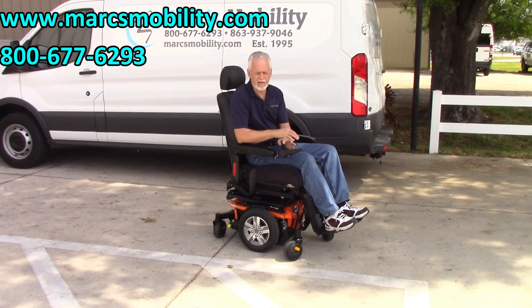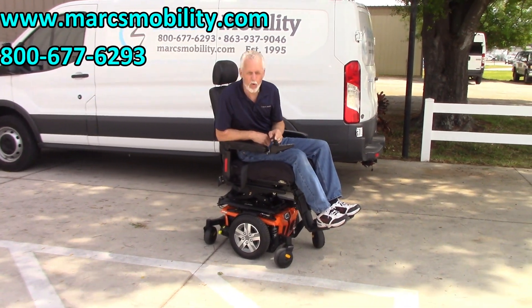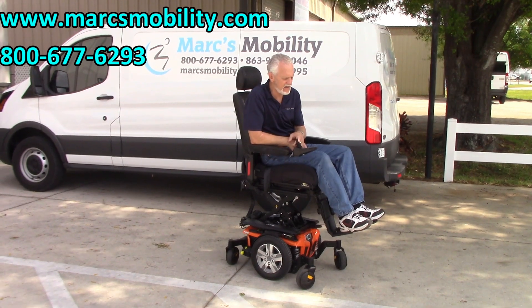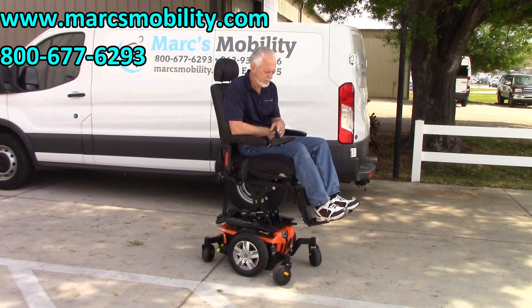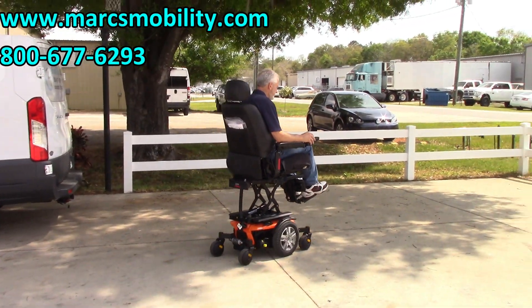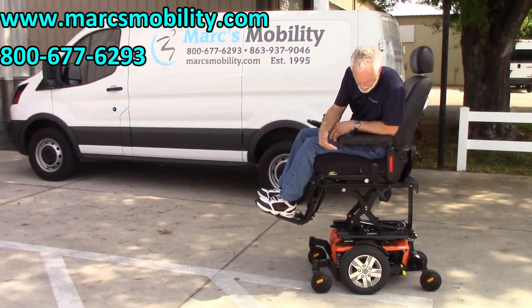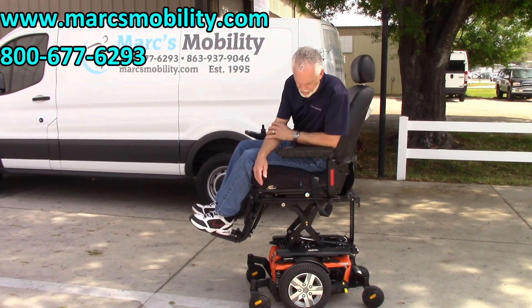I'm going to elevate the seat so you can see me driving it with the seat elevated. This is the Quantum Edge 2.0 — beautiful orange color. It has the 12-inch seat lift and you can still drive this chair with the seat elevated as long as it's on a flat surface. So this power chair is practically new. If you're looking for a beautiful power chair in new condition, this would be a really nice one.